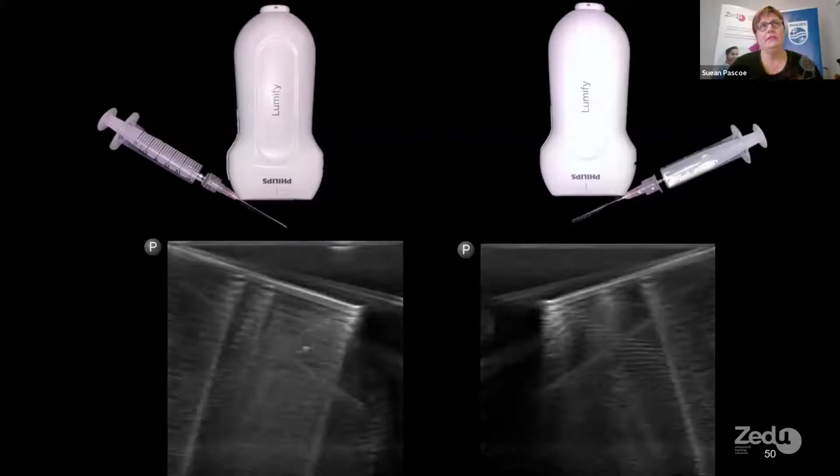And the challenge here, I think, for anyone, especially if you've learned a blind approach to start with, is taking that leap of faith that is now looking at getting your needle into plane, looking at your patient to line everything up, and then trusting yourself to just watch the monitor and guide your progress with the ultrasound. It's a big jump to take, and it's kind of counterintuitive because you're used to putting needles in and watching where you're going on the patient.